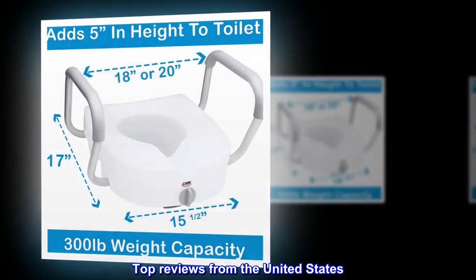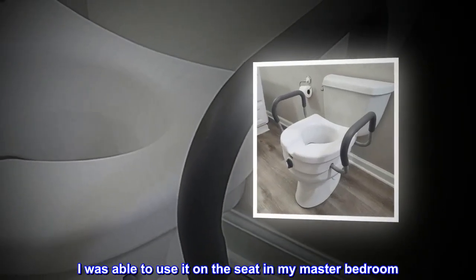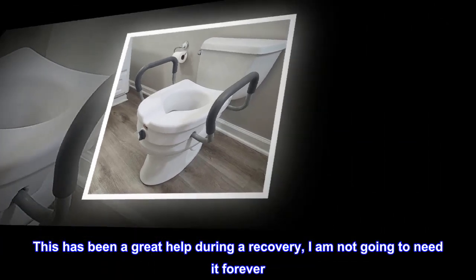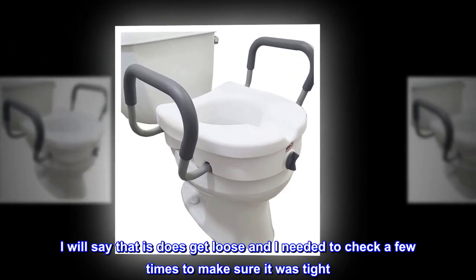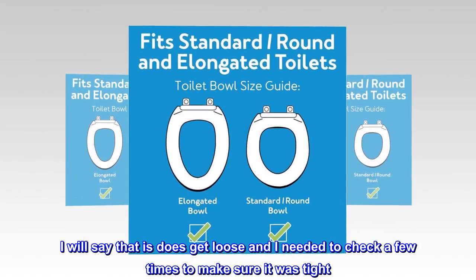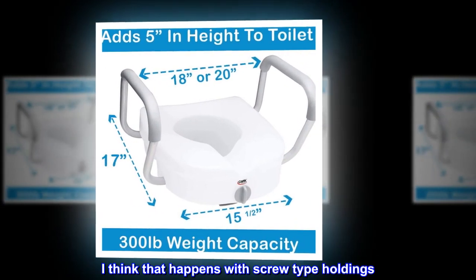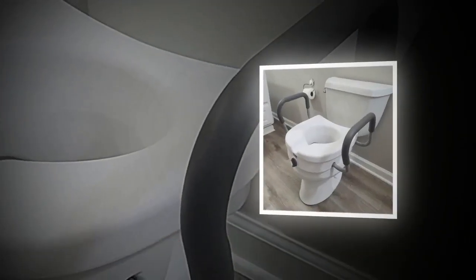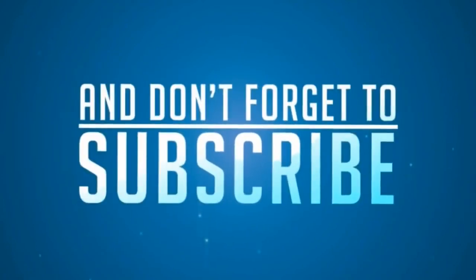Top reviews from the United States. So easy. I was able to use it on the seat in my master bedroom. It was so easy to install. This has been a great help during a recovery. I am not going to need it forever. I will say that it does get loose and I needed to check a few times to make sure it was tight. I think that happens with screw-type holdings. I didn't have to take off the seat to put it on, which was a plus.